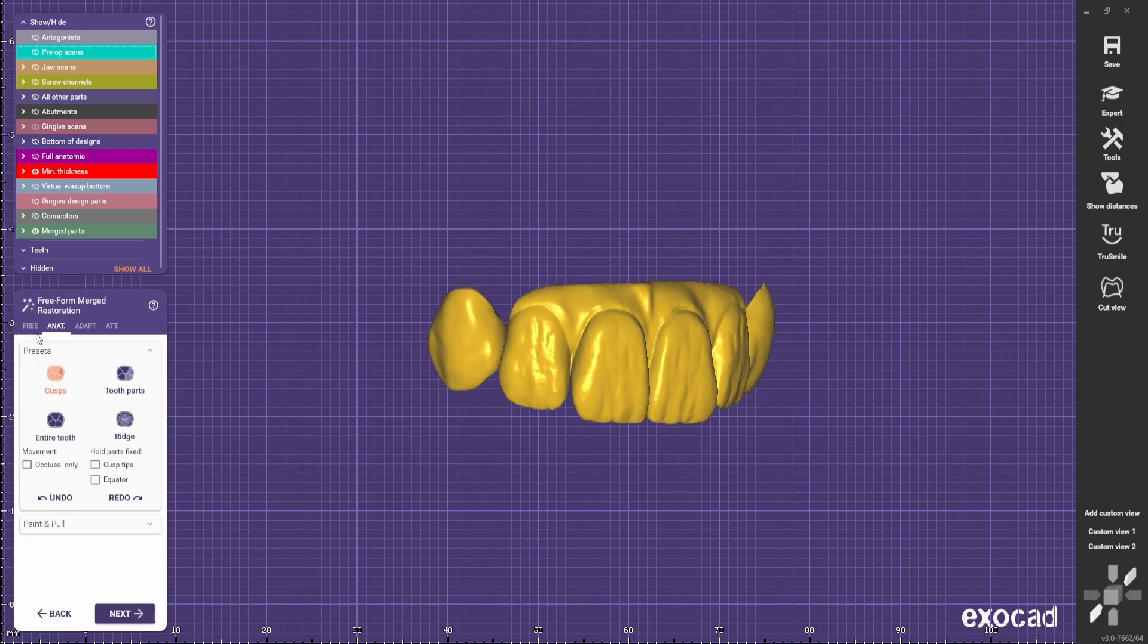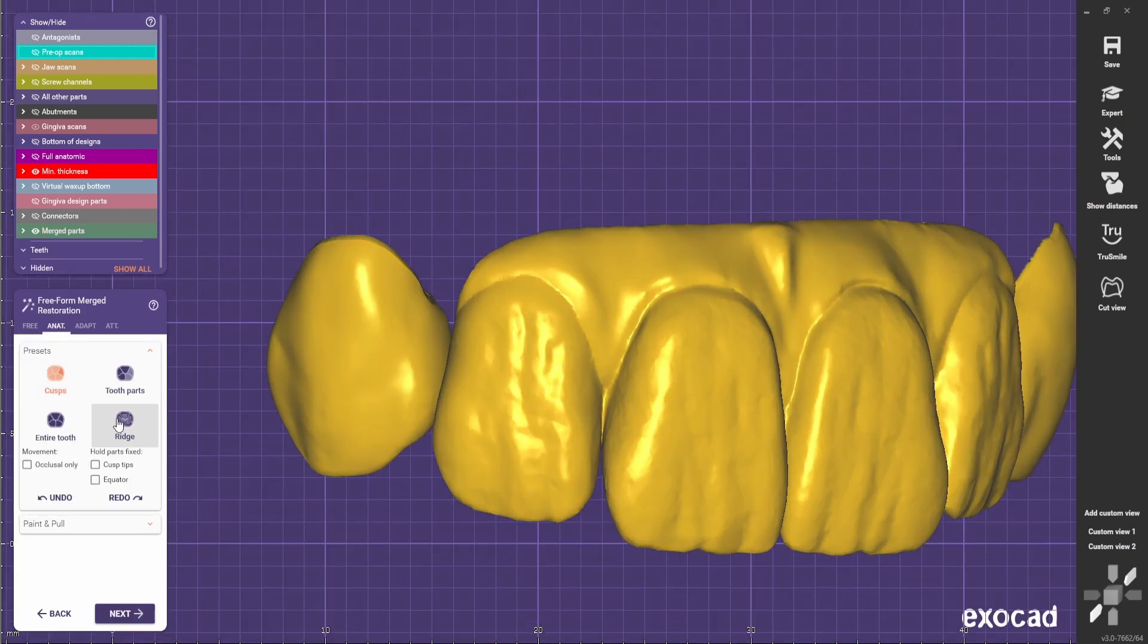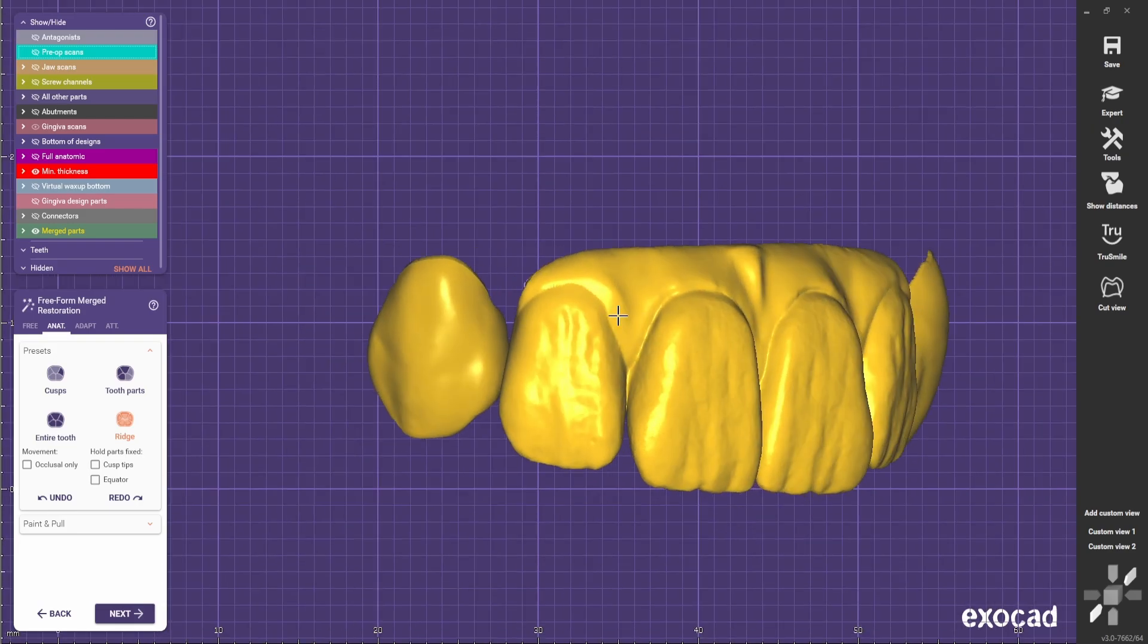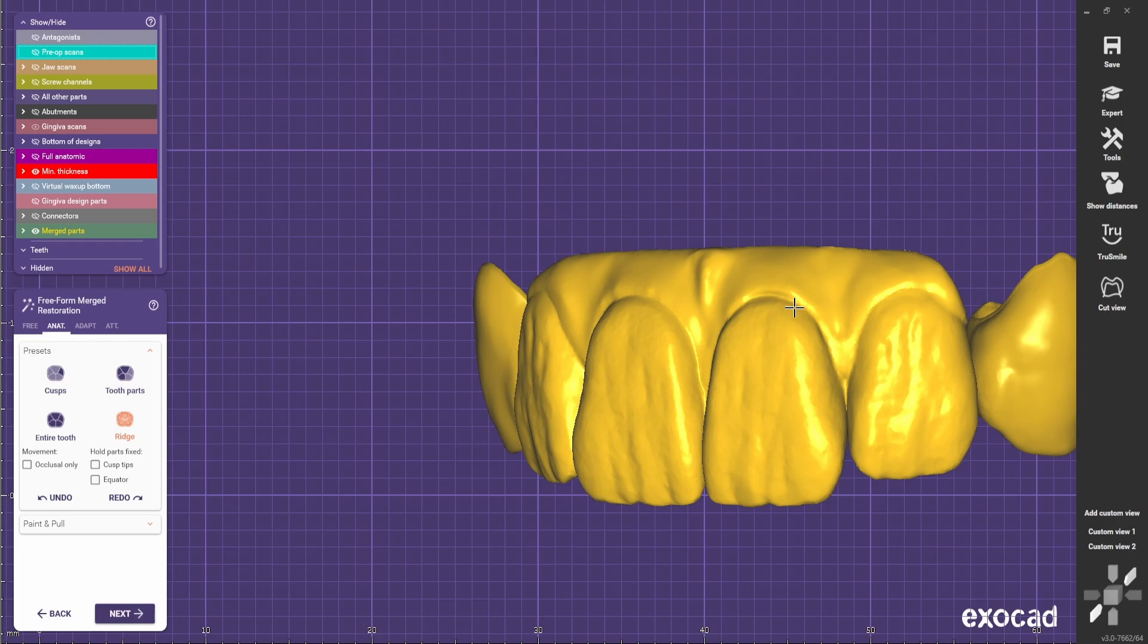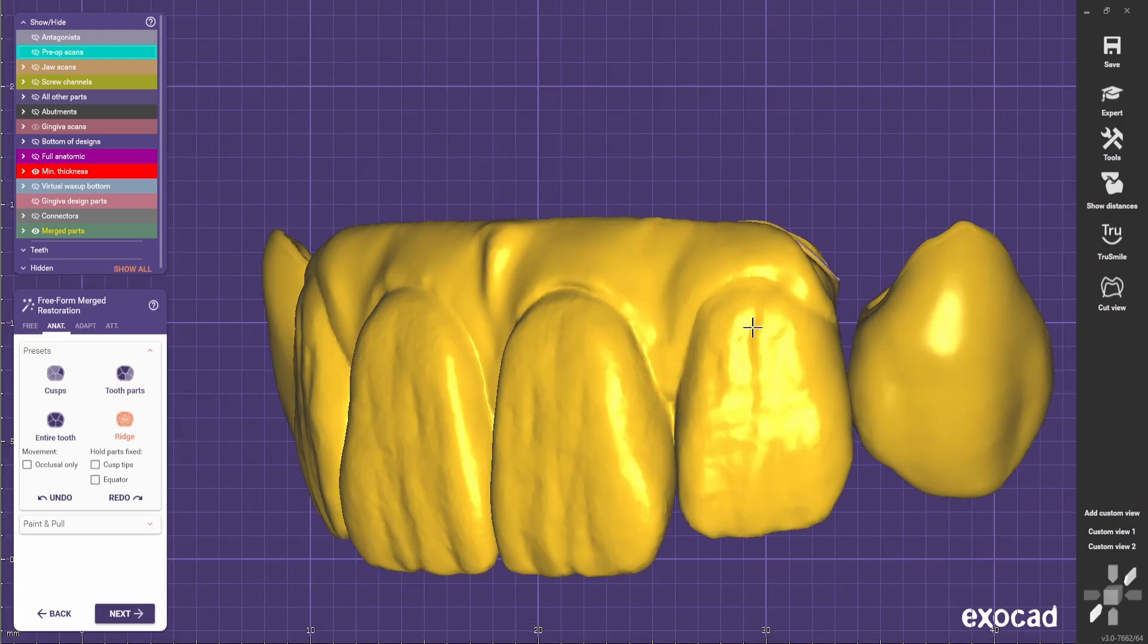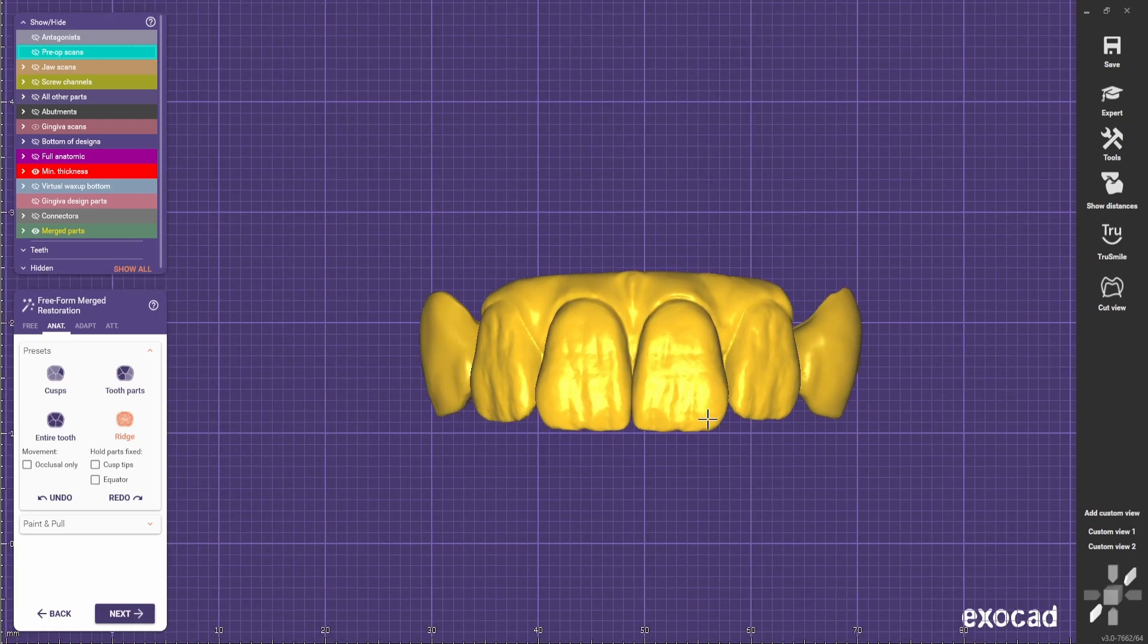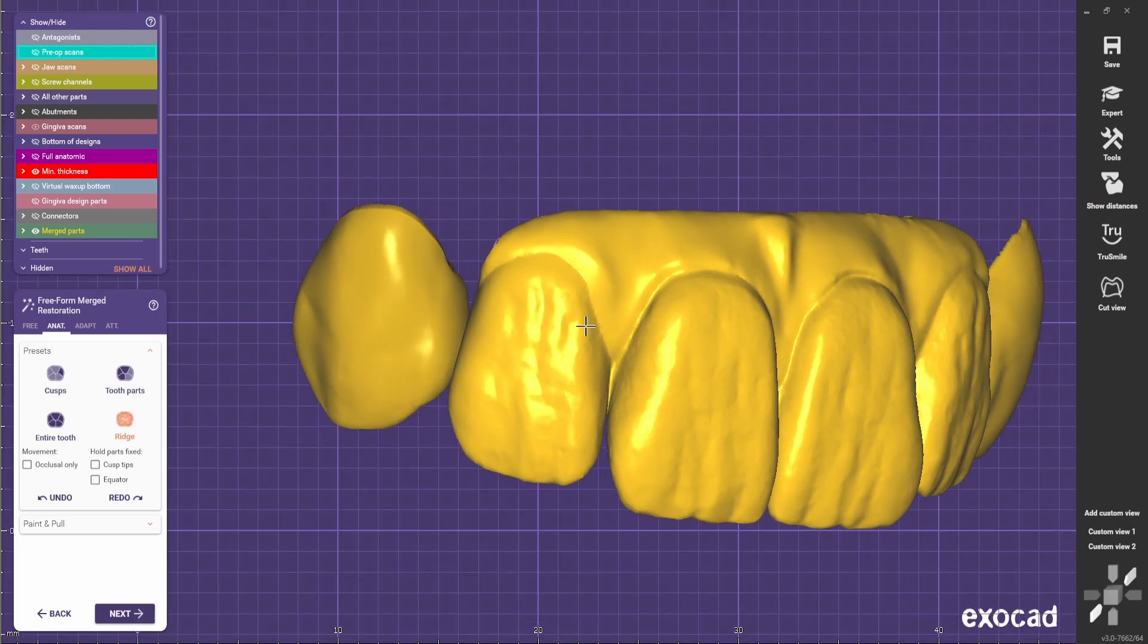First we will use these tools. I'll use the anatomy tool to make the laterals a bit thinner on the neck because they are looking too bulky compared to the centrals. They are almost as bulky as the centrals which is looking a bit off. I like to make them a bit narrower there to make them look more realistic.